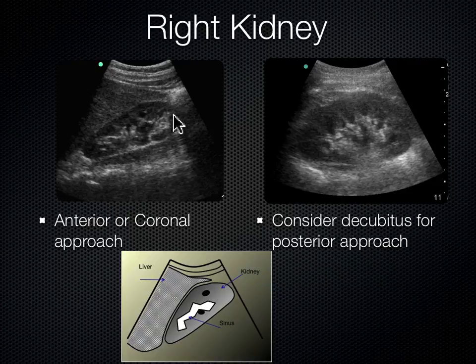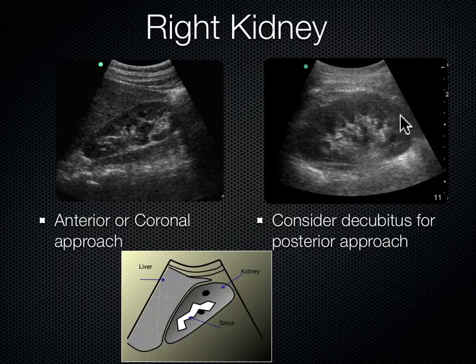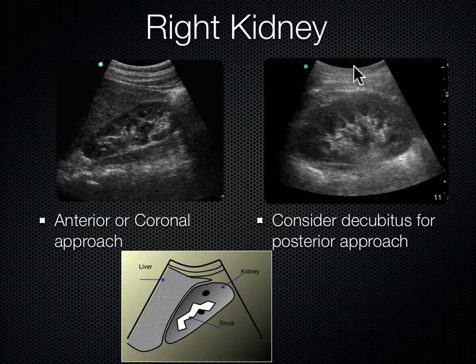When we roll the patient to left lateral decubitus and place the probe between the ribs posteriorly, we can see the kidney in its long axis with no liver in the window — just the kidney. We can also see how close the kidney lies to the skin line, about two centimeters deep in this particular patient with a posterior approach.